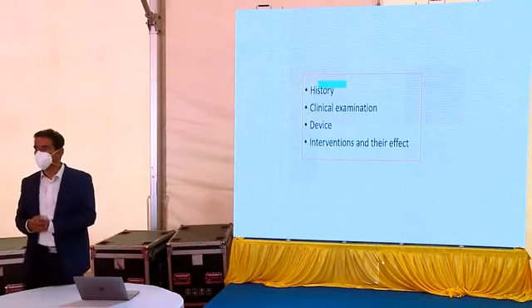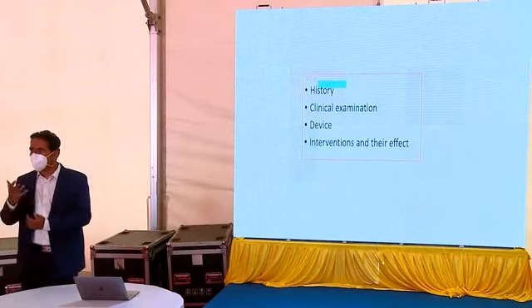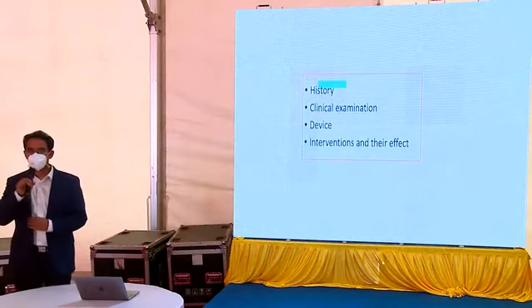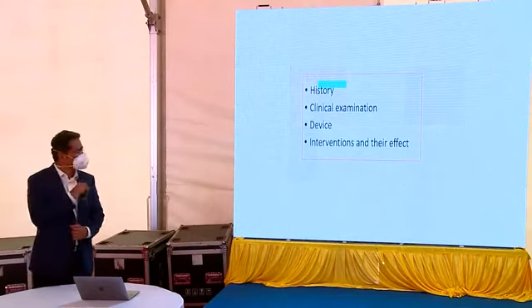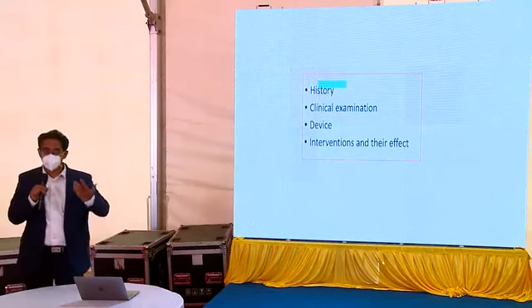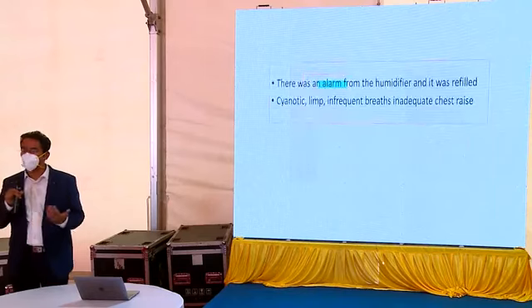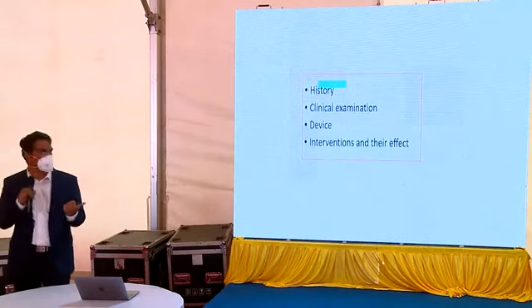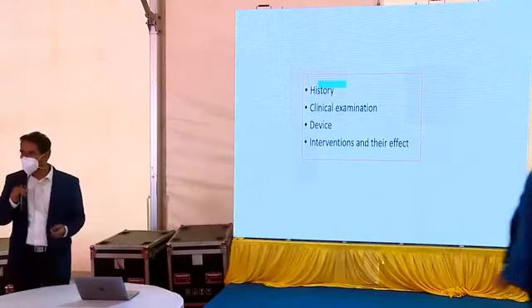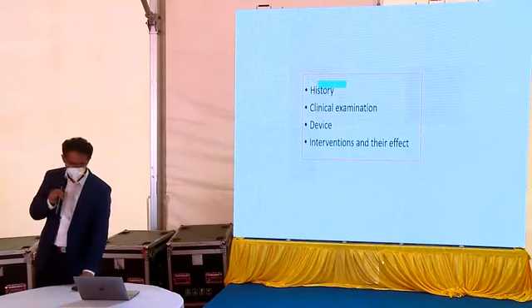Seek more information about this baby. Of course, we don't have a lot of time, but within that brief few seconds, a minute that you get, we have to have as much information as possible. It is always better to go methodical and speak to the person who was with the baby and ask what actually happened. Most of the time, this itself would solve the issue. Briefly examine and see what the ventilator is saying, and then test or not.